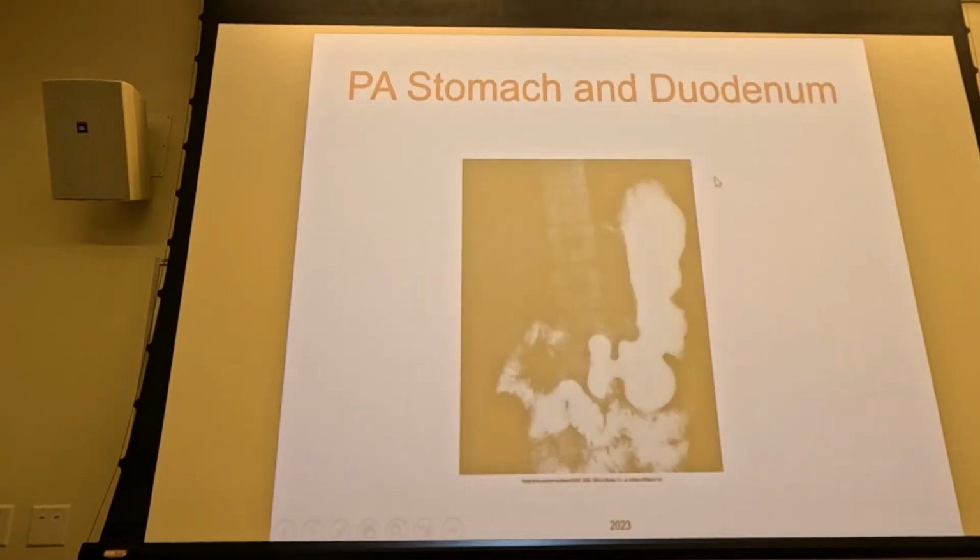All right, so here we go. PA of the stomach. PA of the stomach, again, the fundus is up. And we can see the air in the fundus of the stomach. And we've got the body and some in the pylorus.